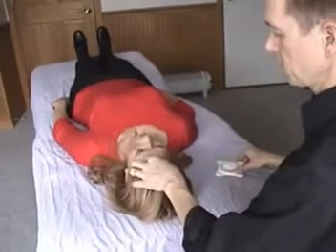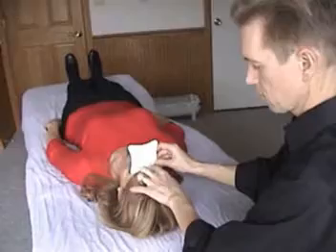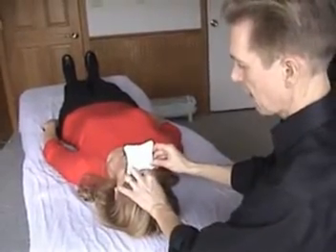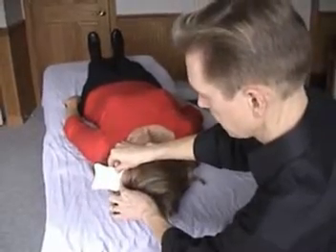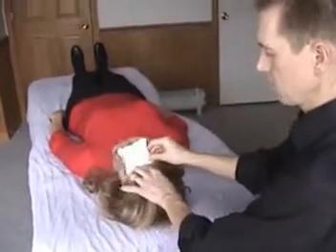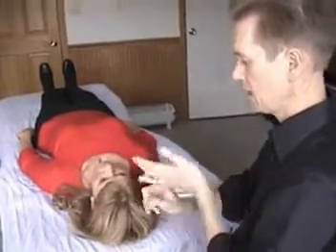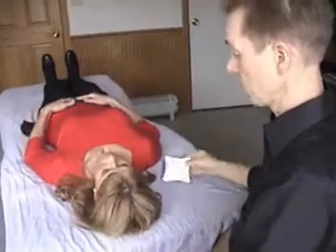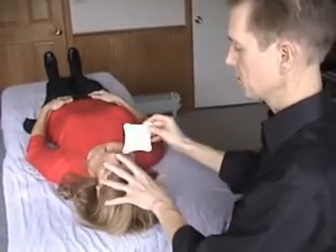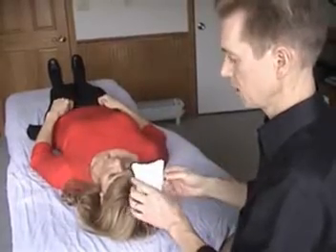Just make sure that the rotation is pure. In terms of using the inclinometer, it's quite easy. All you have to do is set it on the forehead, have them turn, make sure it's pure rotation, and just read the number. It's a very easy and very quick way to measure range of motion. What you want is speed and accuracy — the quicker and more accurate it is, the more likely you are to actually measure multiple times during a session to see what's helping to change the range of motion and what's not.